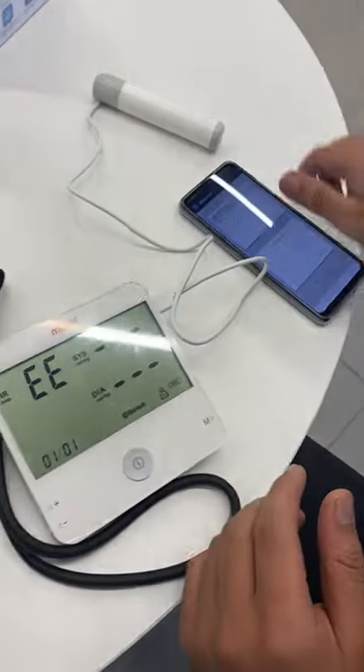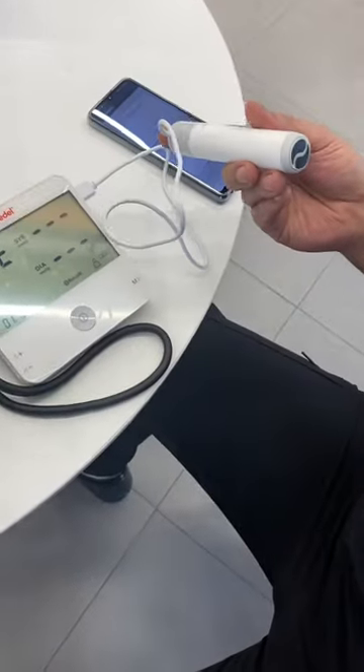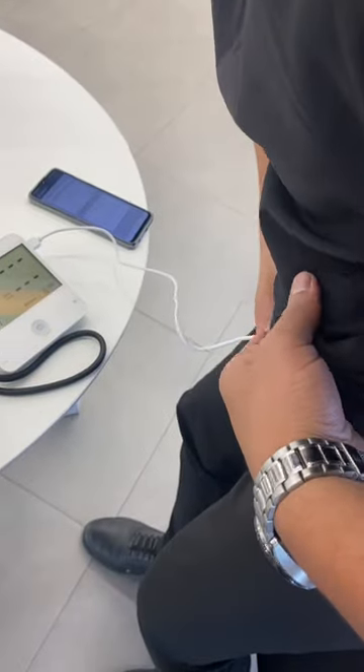Then position this for ACG — place the index here, under the navel, about five centimeters, like this. Put it here like this.